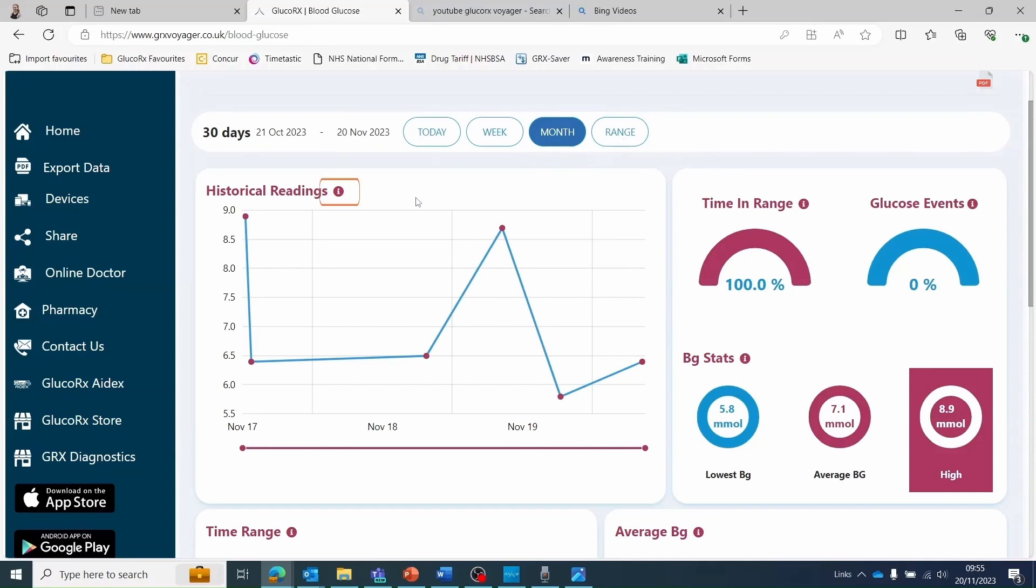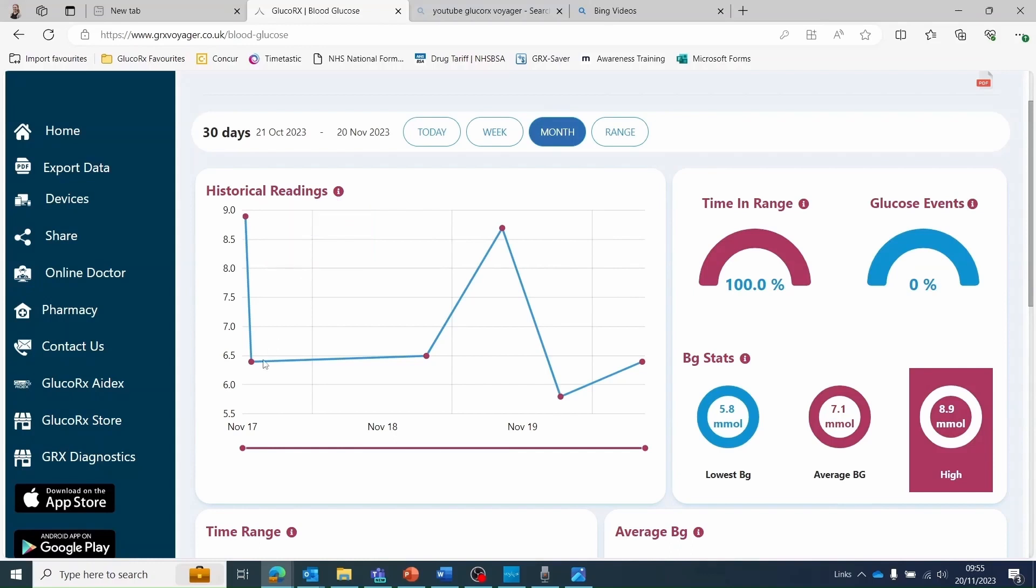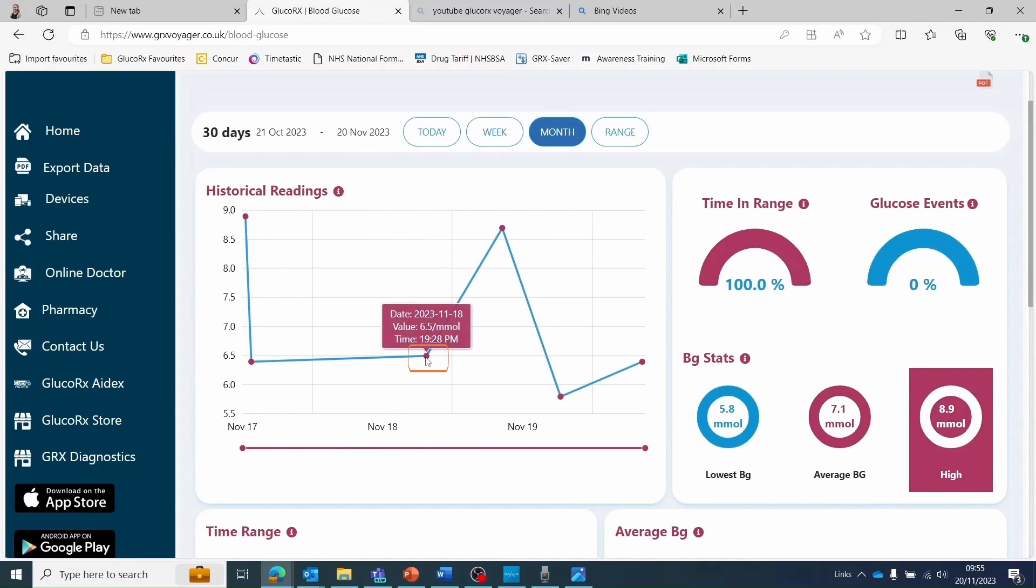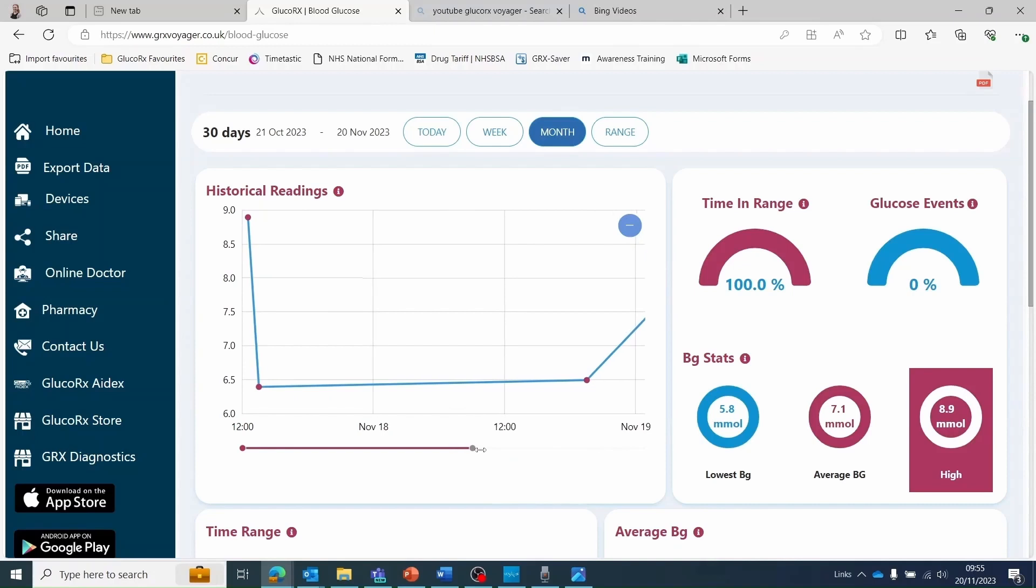There are information symbols next to each section to let you know what the data is showing you. The historical data graph is interactive. Hover over each data point to view information on the reading or you can zoom in on the scale if there are lots of data points.